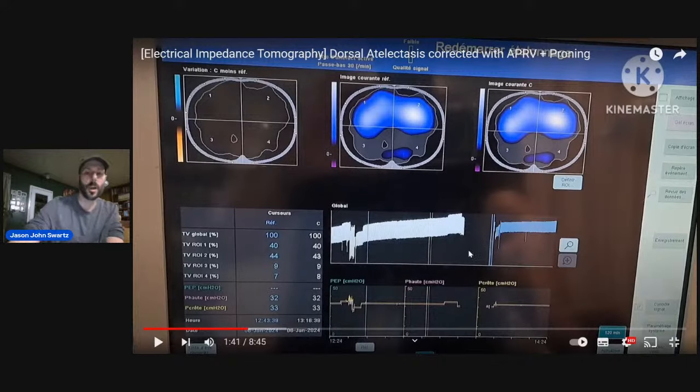So for this one here, you press the reference, so the reference becomes locked in, and this reference was the ACPC. And then, because we're connected to the Draeger machine, it knows all the different P high levels that I was adjusting. So you can see up here it's going up and down. I'm trying various P high levels. And so what I'm doing now, I'm scrolling back so that my reference and my control area are equal. And we're going to start scrolling as we go down the timeline.